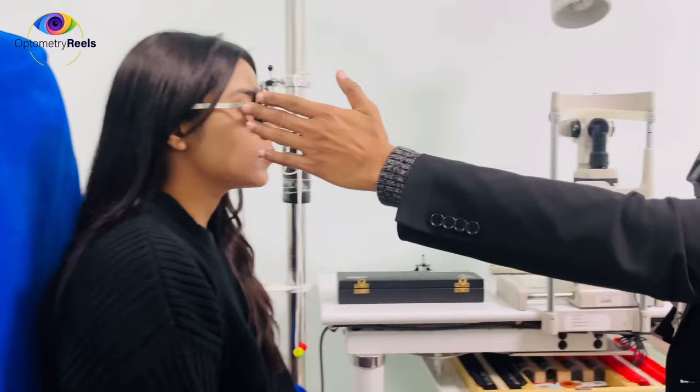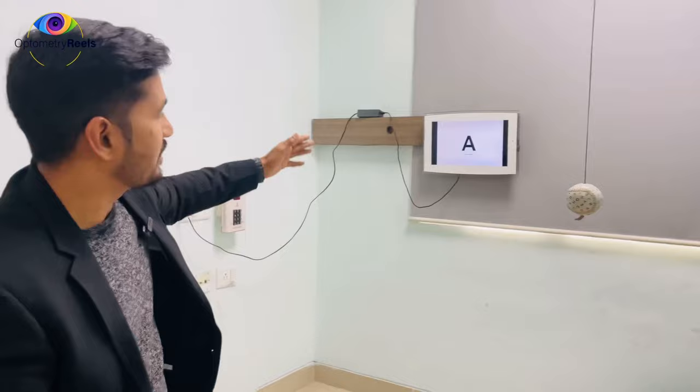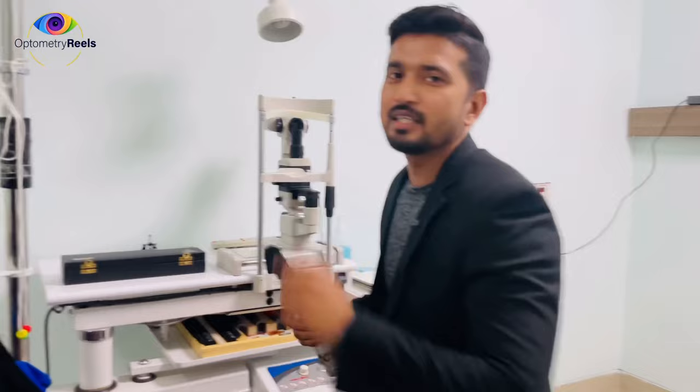Before doing retinoscopy, one should know a few important points. First is the alignment of the trial frame and your working distance. My working distance is 67 centimeters, so at the end I will deduct accordingly to get the net value. The target given is a distance target of 6/60 to relax accommodation.